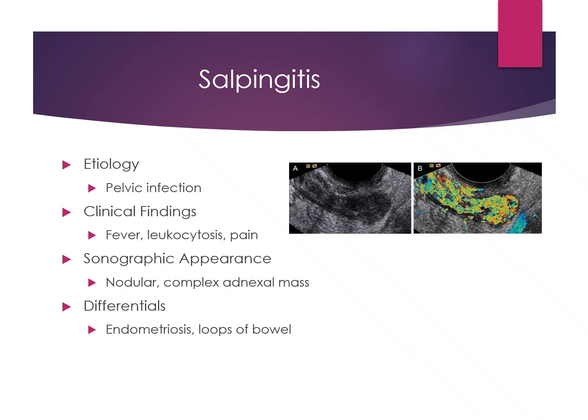And then the real determining factor almost for salpingitis is going to be your increased blood flow. So if I was to turn on color onto my fallopian tube and it lit up like a Christmas tree, then I'm going to be thinking some serious infection going on above and beyond hydrosalpinx.